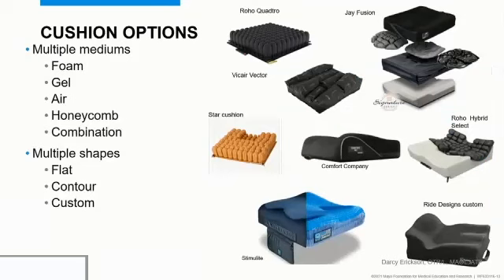So that means we look at cushions, right? And cushions, there's cushions for days. There's cushions of all sorts. There's cushions of all names. You can't even keep track of all the cushions. And then everybody wants to drill it down to what's the best cushion. I only want to get one, so what's the best cushion? And we're like, oh, I don't even have time to go over all the options for cushions.